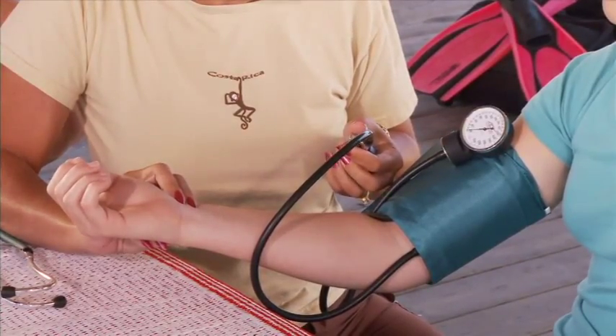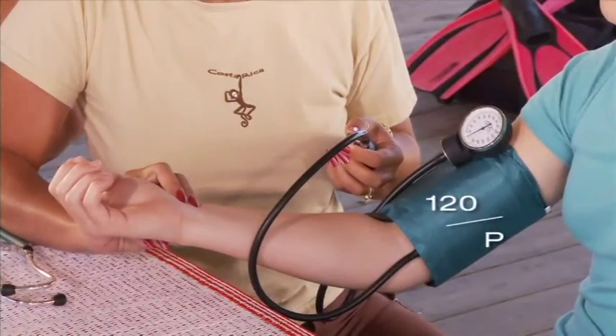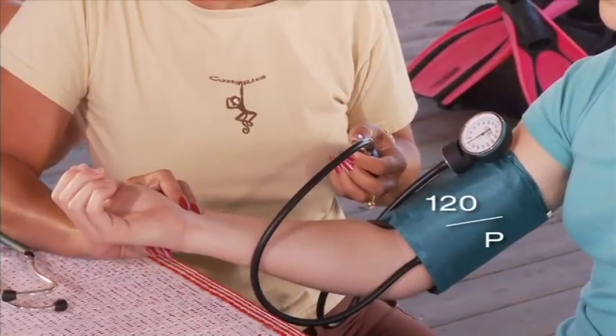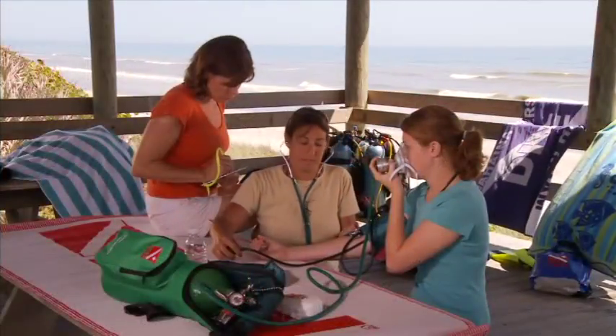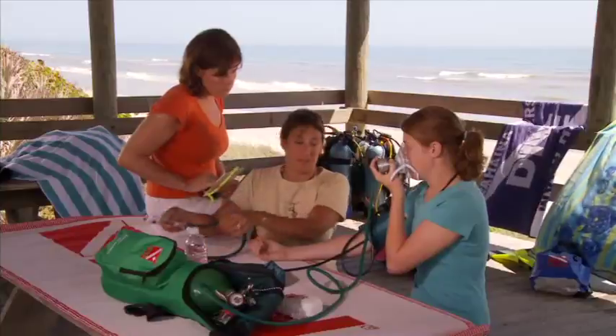You will not be able to record the diastolic number using this technique. Record the pressure as 120 over P to show that it was measured by palpation. Leave the blood pressure cuff in place but deflate it so you can take the pressure again later.